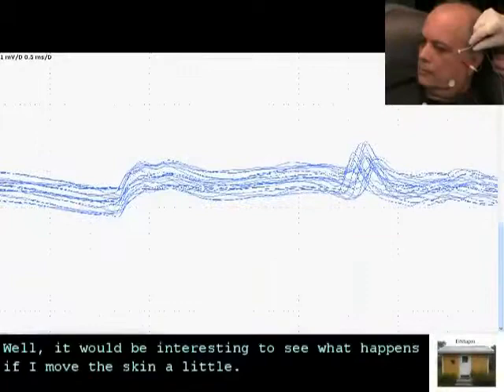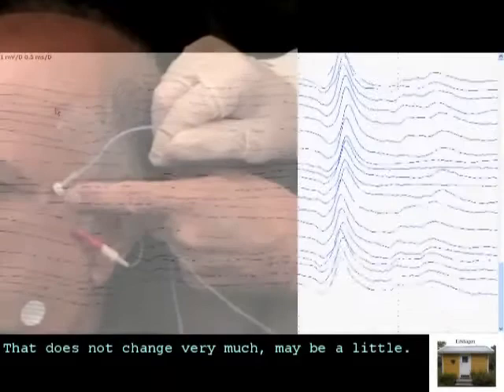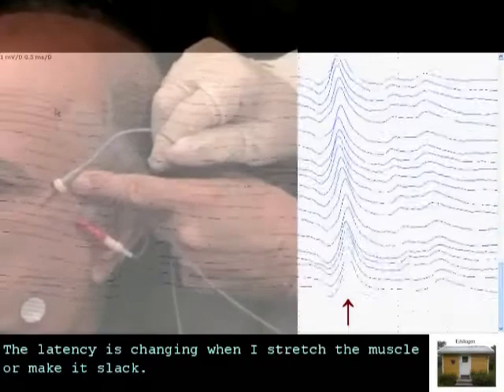It would be interesting to see what happens if I move the skin a little. It does not change very much, maybe a little. The latency is changing when I stretch the muscle fibers — or the muscle actually — or make it slack.